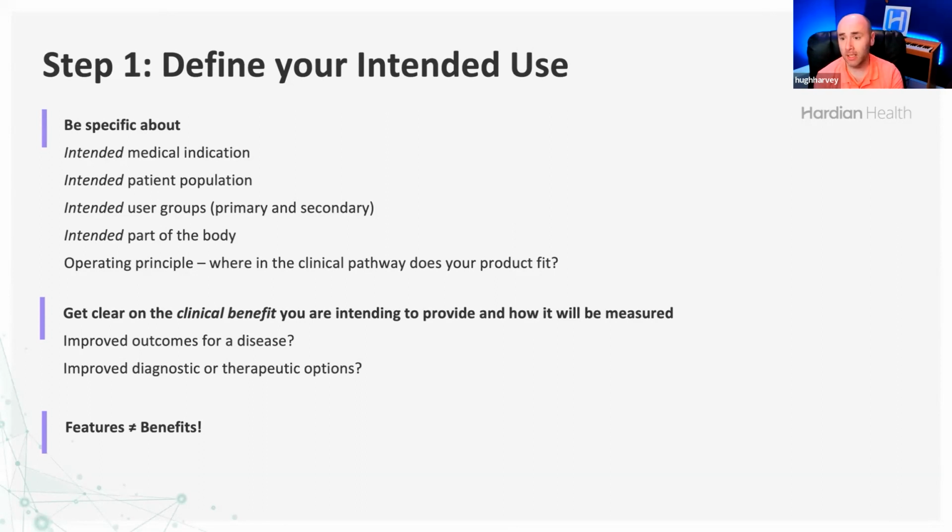And really importantly, features do not equal benefits. And what do we mean by that? So a feature might be that you have a nice user interface that's simple to use. That's not a clinical benefit. You can't measure a clinical outcome based on a user interface, for example.